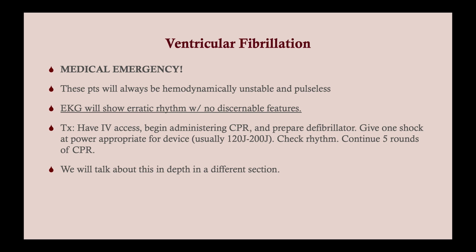The treatment is, as we go over in the code blue section, you want to have IV access, begin administering CPR, and prepare your defibrillator. You want to give one shock at the power appropriate for the device, usually between 120 and 200 joules. Check the rhythm and then continue 5 rounds of CPR.